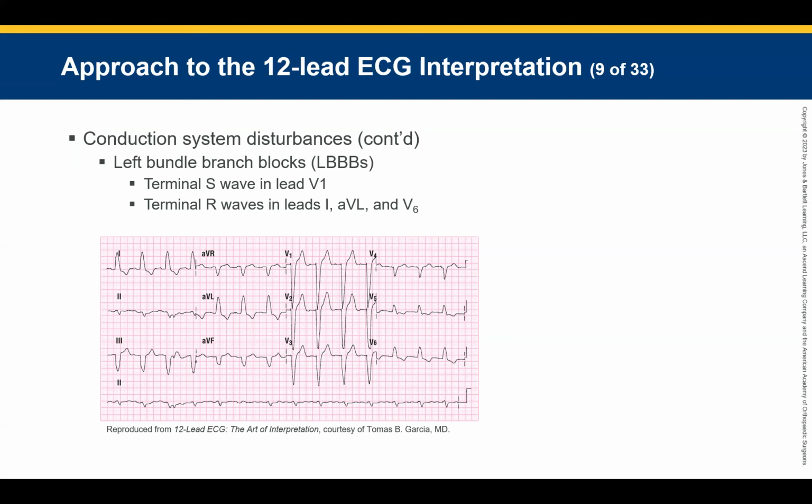You have P waves, you have a QRS that is nasty and wide. It's a sinus rhythm. The only reason we know it's sinus rhythm is RRs are regular, PRIs are equal. We have P waves, so we have to be over there, even though it's wide and it's not supposed to be wide. So that width throws us off of our normal chart.